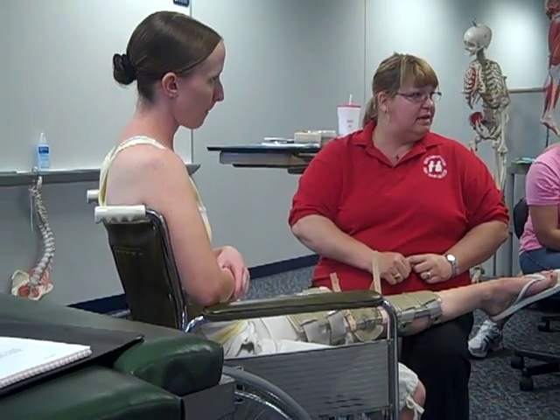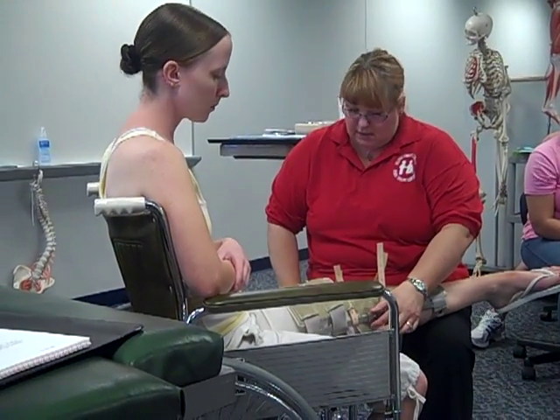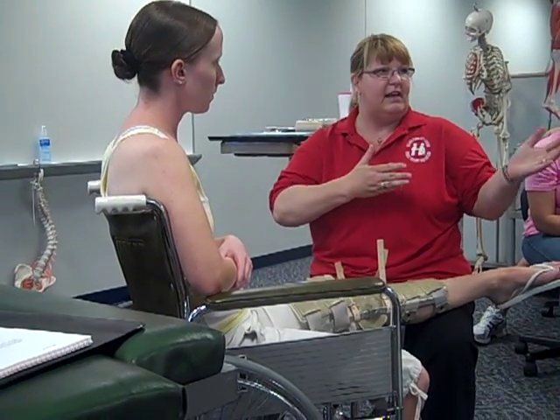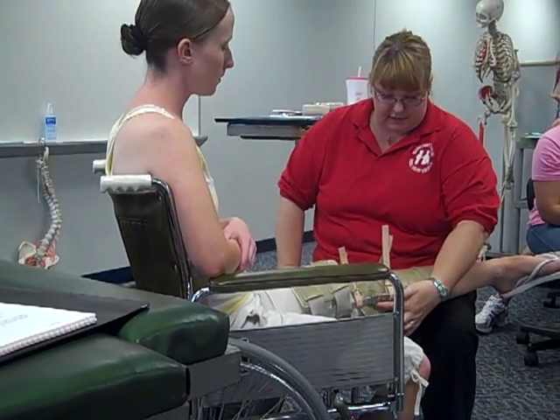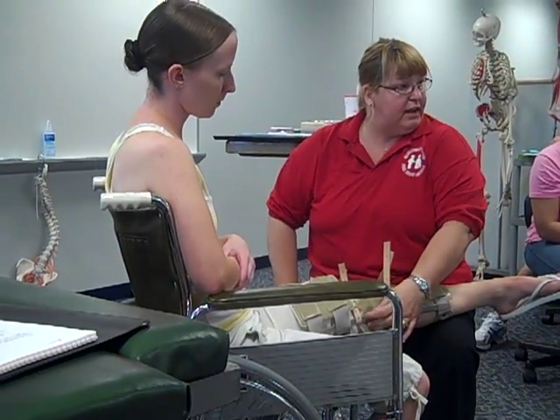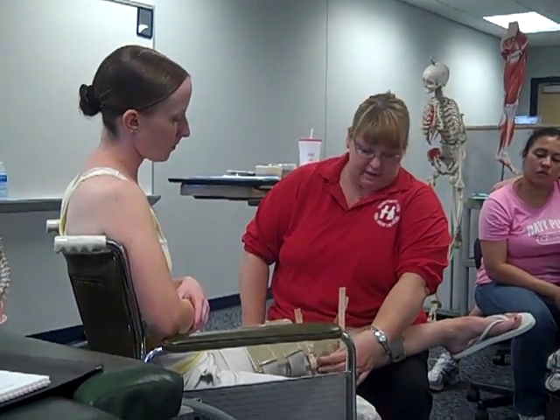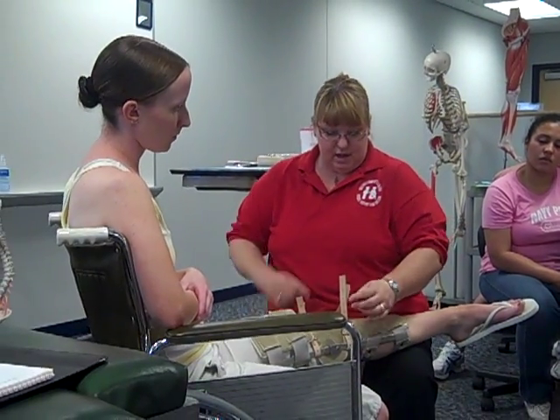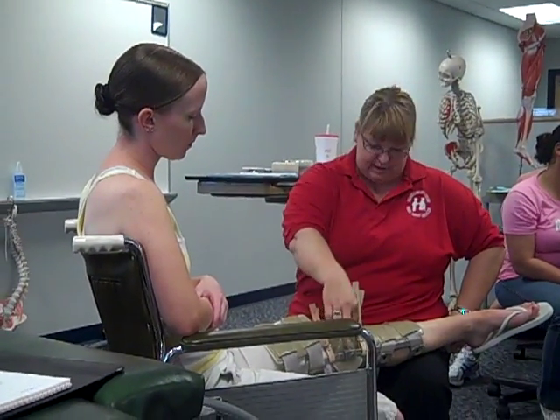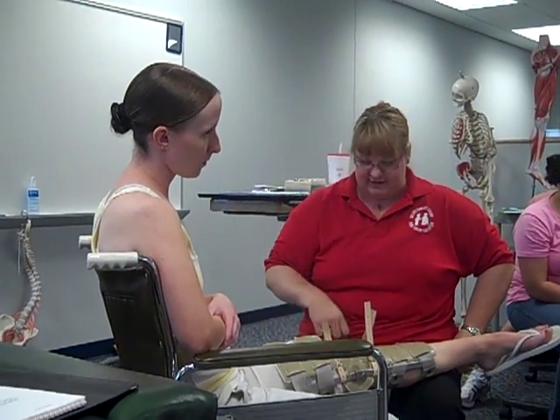Any questions about the knee cage? The drop locks — they stay put pretty well, but if somebody backs up to a chair and it hits, once it gets up a little bit it can be knocked off fairly easily. So make sure the patient is double-checking. When putting this on, make sure the straps are out of the way before you start tightening them so you don't have the lock above the strap — that would make it really hard to lock it down.